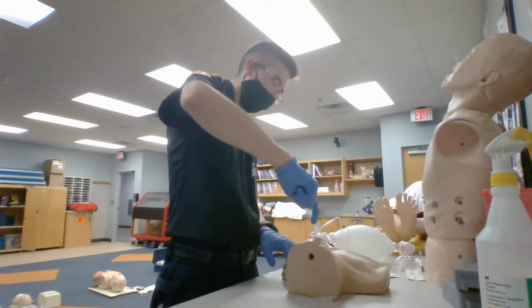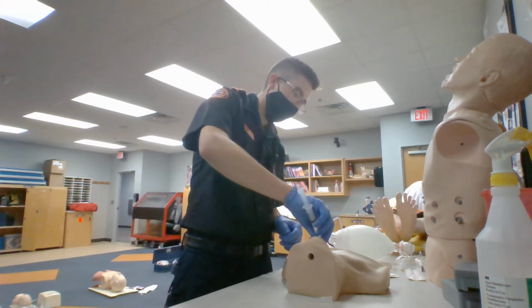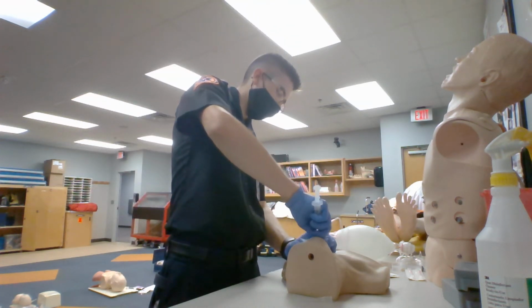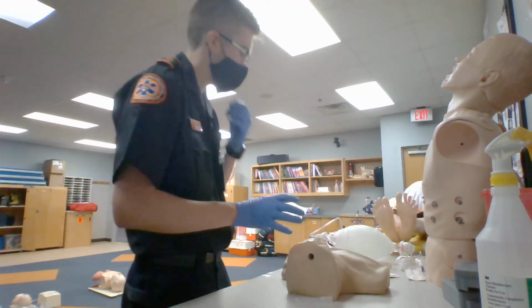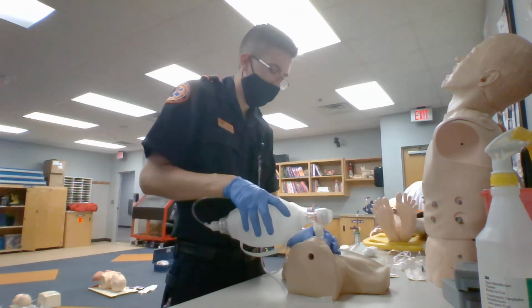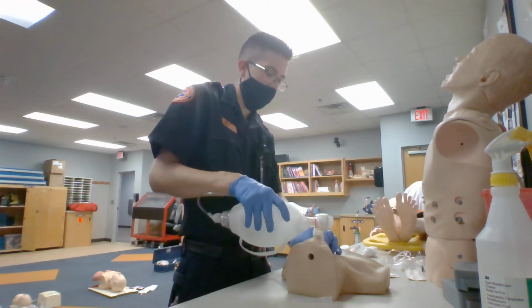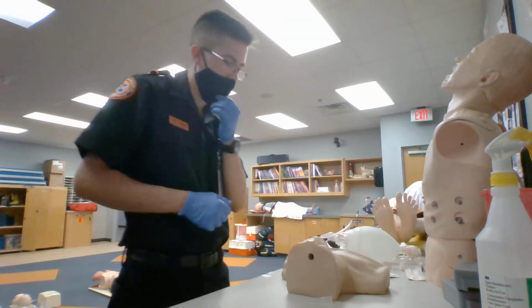Once I have done that, I'm going to aspirate the syringe, see if I can get any bubbles, which I did. If I get bubbles, that's another way that I can confirm proper placement. After I've done that, I'm going to advance my catheter, remove my needle, put all of that in the sharps container. Then I'm going to come over and attach my BVM or my ventilator with my ET tube adapter to my needle. And then I will ventilate my patient, continue to ventilate my patient, monitoring for adequate chest rise and fall.